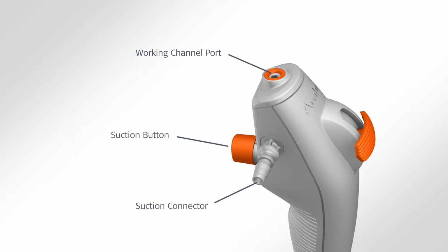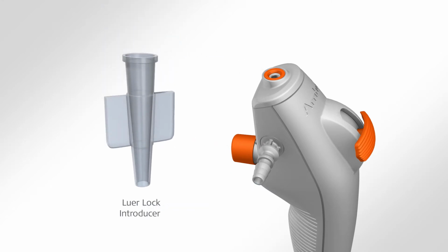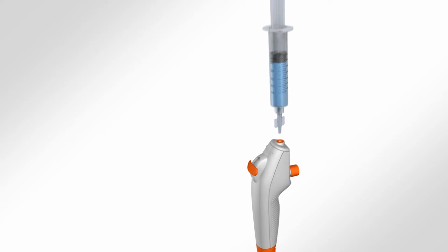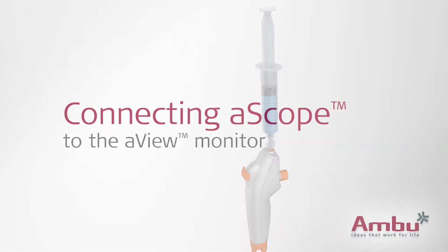The aScope comes with a luer lock introducer, which fits into the working channel port to facilitate introduction of luer lock syringes and endoscopic accessories. To use the introducer, insert it into the working channel port and push firmly.